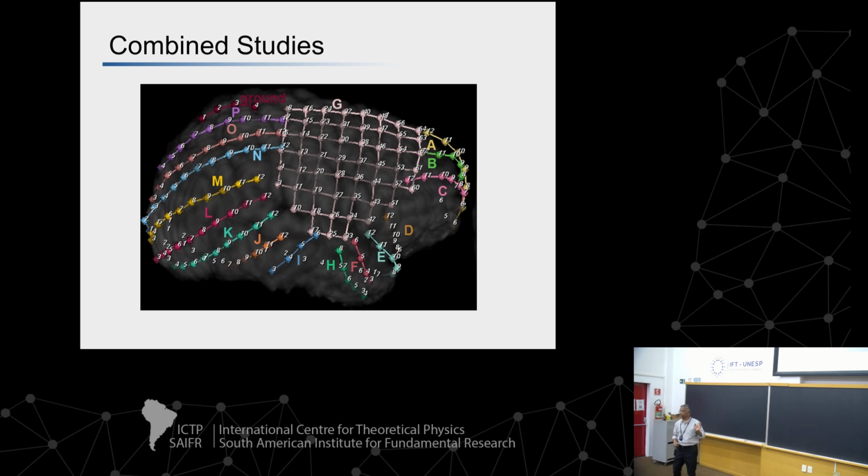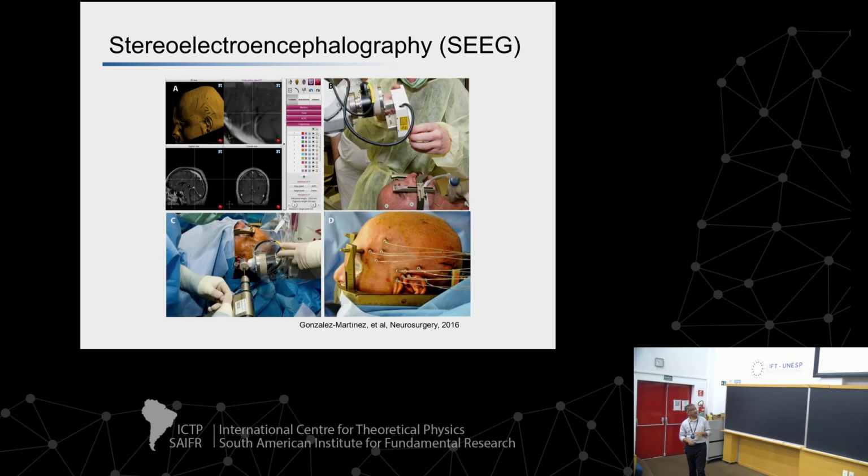More recently, this has changed. The kind of electrodes we use throughout the world has changed, and it's changing dramatically. There's more of a use of SEEG electrodes. These are like the depth electrodes I showed, because we now have robots that can place these electrodes in a pretty efficient manner and fairly safely and very targeted.